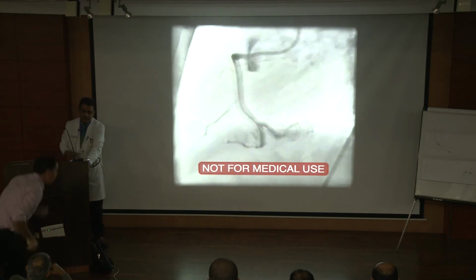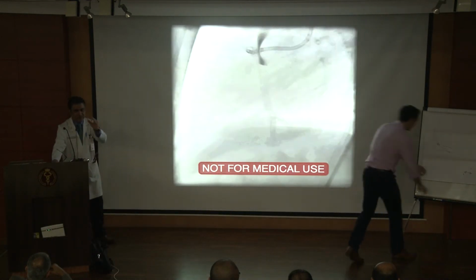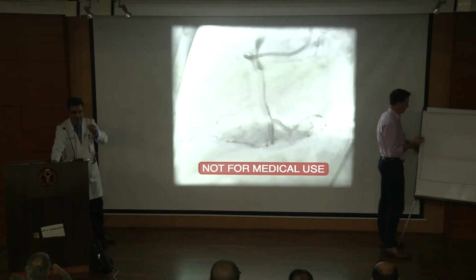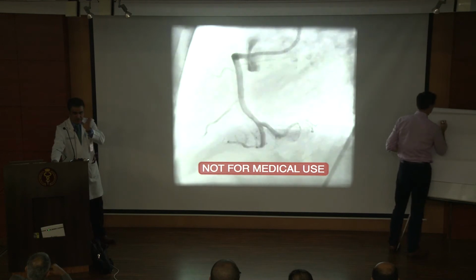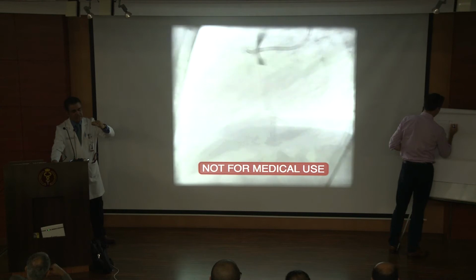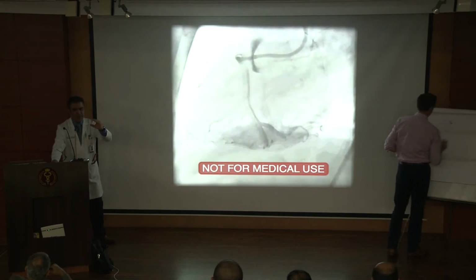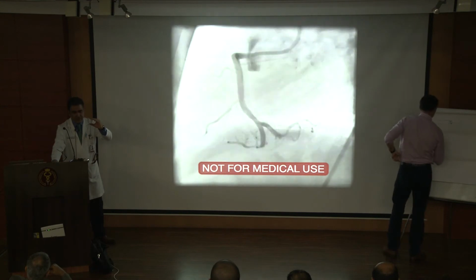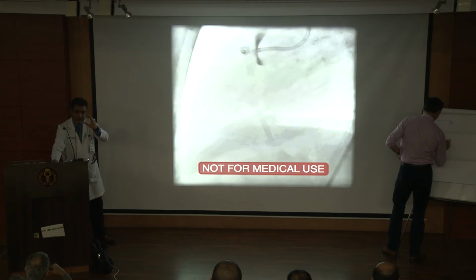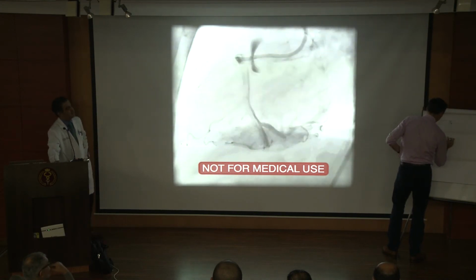Well, one thing is when you pull the stent out and you put it in the ostium, you see it suddenly flips out. That means you're very close to the ostium. There's a feel of it angiographically when you're at the ostium or not. I don't know if you noticed that sometimes when you position the stent at the ostium, you just pull it back, you see a little bit of a lift. When that lift happens, you're very much covering the ostium, but not too much. Colin, do you have a better way to explain than I did?